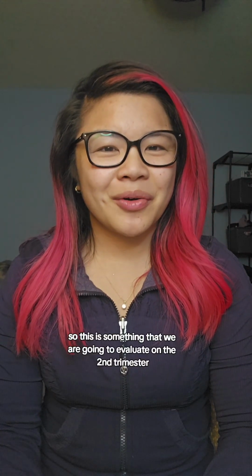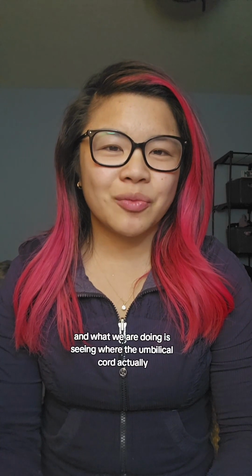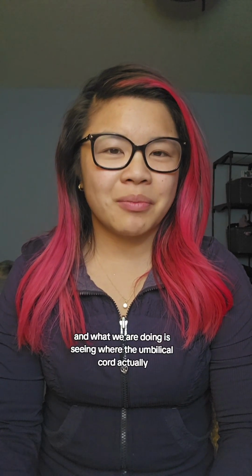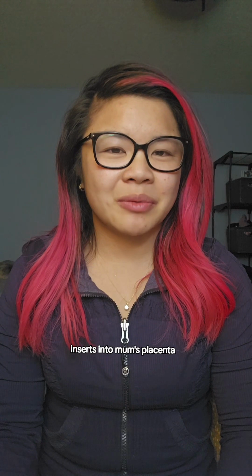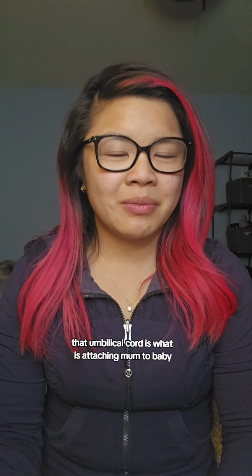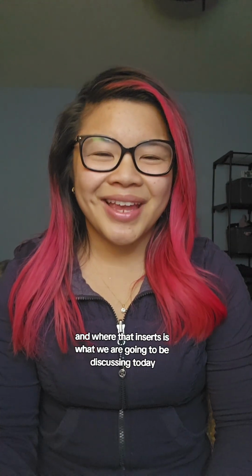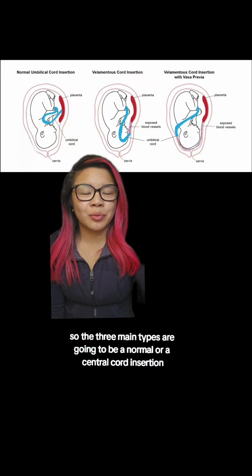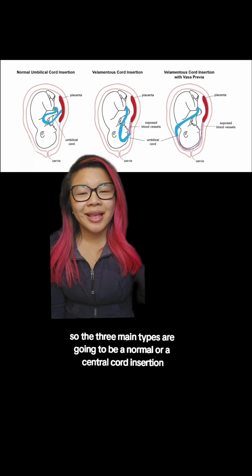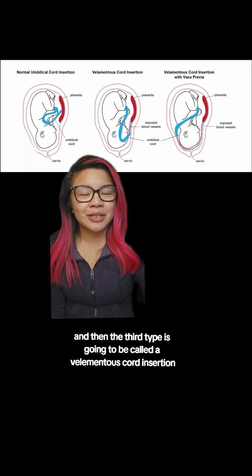Anyways, back to placental cord insertions. This is something that we are going to evaluate on the second trimester anatomy scan on baby. What we are doing is seeing where the umbilical cord actually inserts into mom's placenta. That umbilical cord is what is attaching mom to baby, and where that inserts is what we are going to be discussing today. So the three main types are a normal or central cord insertion, the second type is a marginal cord insertion, and the third type is called a velamentous cord insertion.